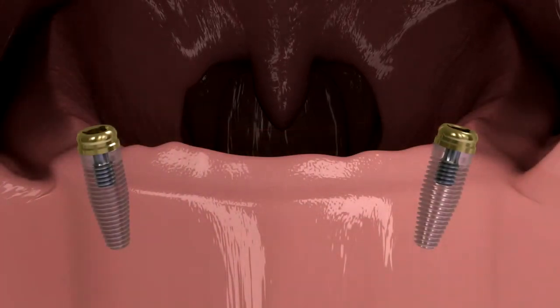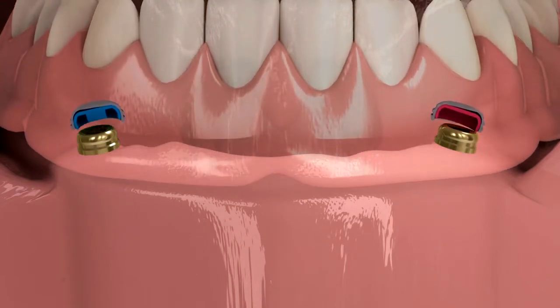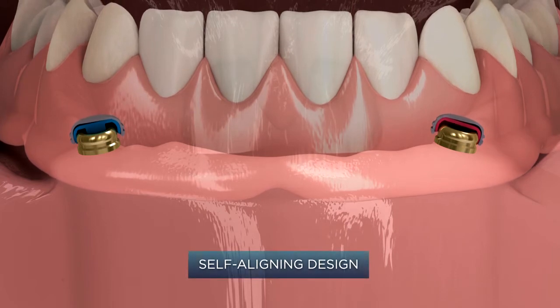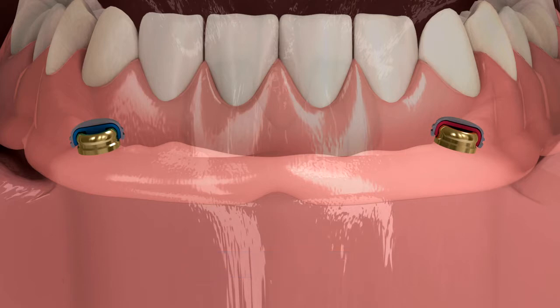During seating, while the Locator male pivots inside the denture cap, the system's self-aligning design centers the male on the attachment before engagement. These two actions in concert allow the Locator to self-align into place, enabling patients to easily seat their over-denture without the need for accurate alignment and without causing damage to the attachment components.